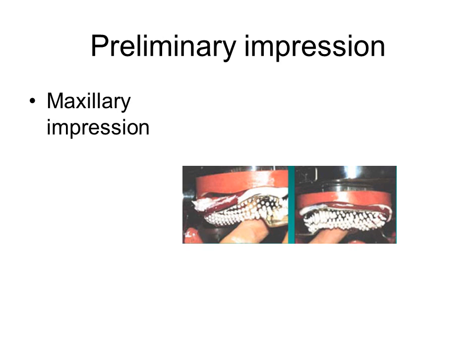Using the finger, swipe alginate onto the palate and the labial vestibule. Ask the patient to close slightly. Rotate the impression and center over the ridges. Seat the tray. Pull the lip out and down. Ask the patient to suck down on the tray like drinking from a straw. Open and close the jaw. Move the jaw side to side.